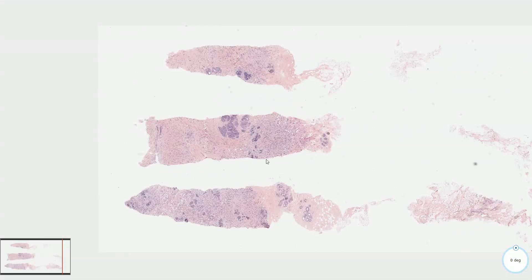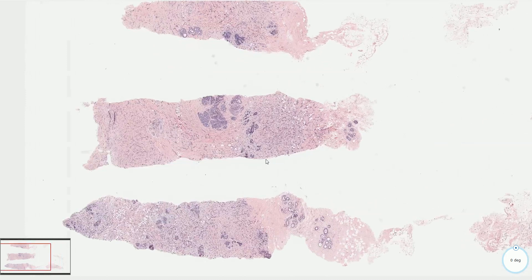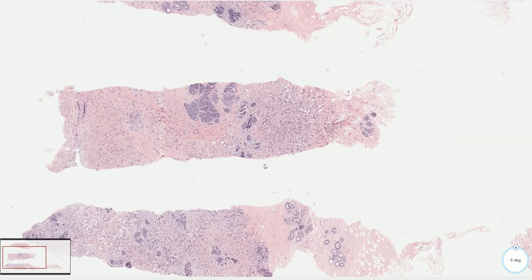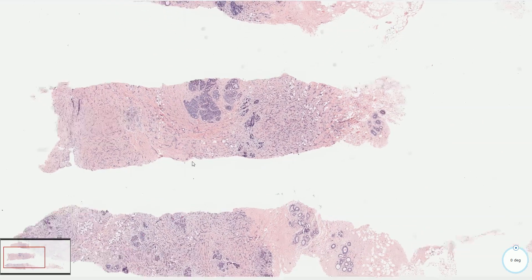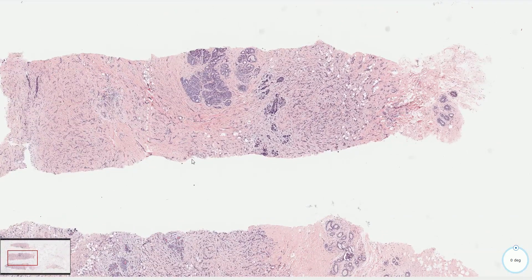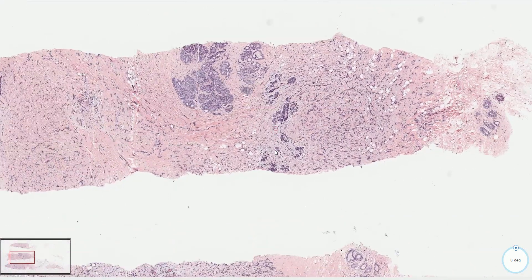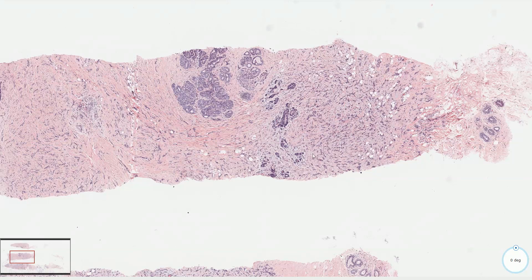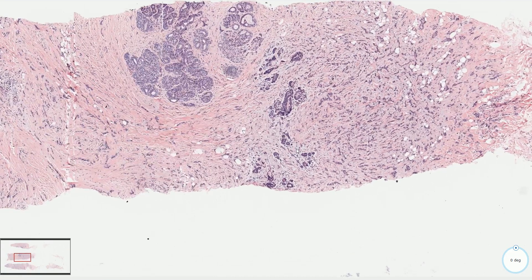Tubulolobular carcinoma is a rare low-grade invasive carcinoma of the breast which consists of tubule formation and single cell lobular pattern. It has very distinctive morphology. There is a discohesive component which looks like lobular carcinoma, and the second component consists of these small round tubules with punch-out lumina formation.